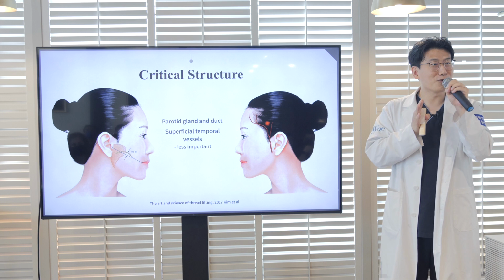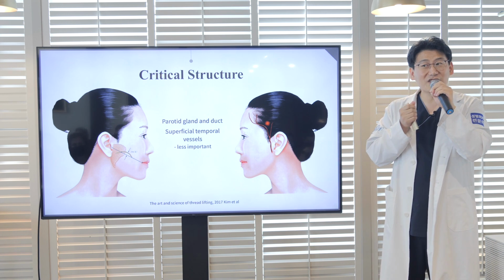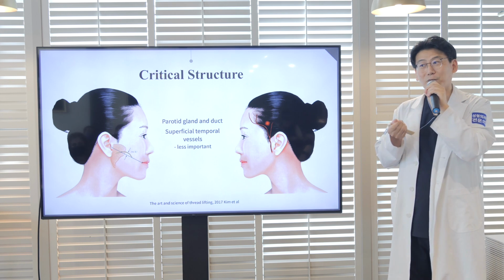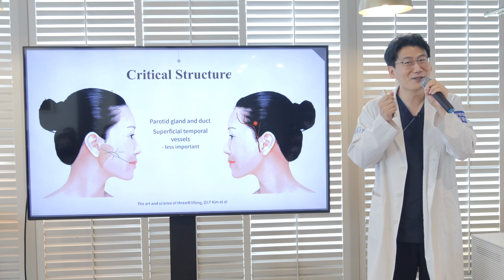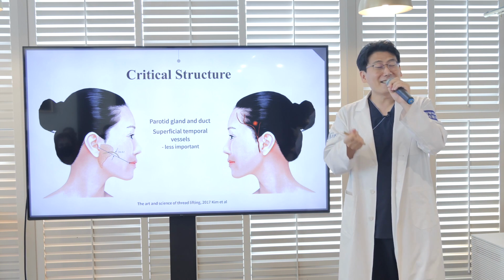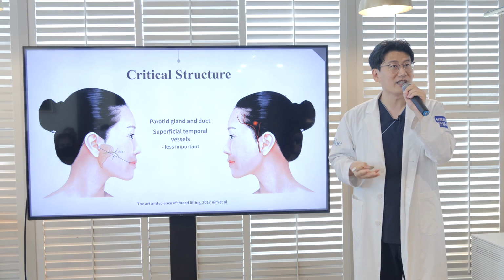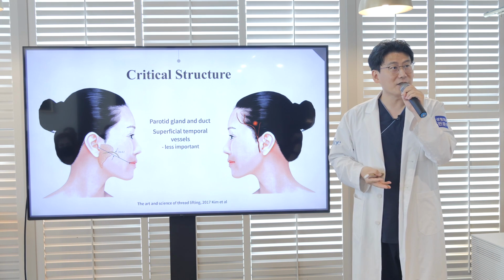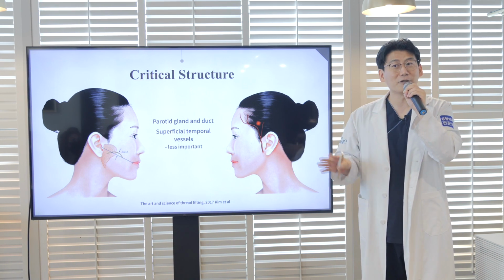But anyway, you should be very cautious when you insert the thread around the territory of the parotid gland. But once you commit some side effect, it's okay. It can be approached conservatively. Give them some medication, painkillers and antibiotics. It will disappear day by day.